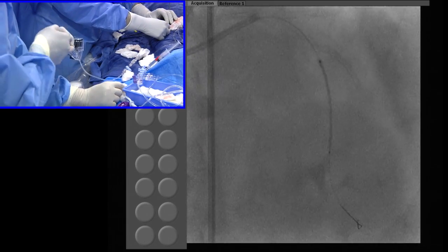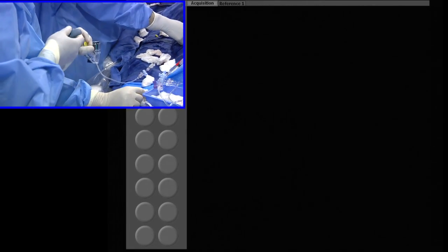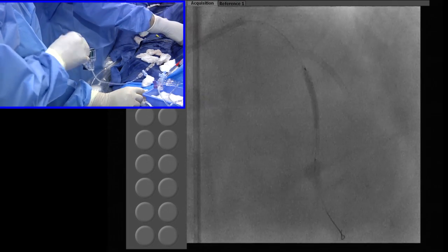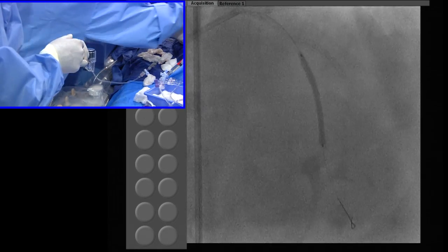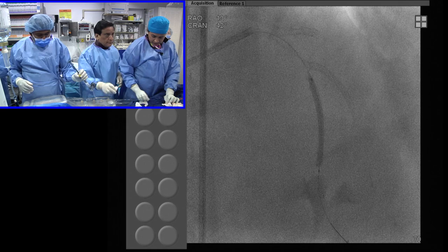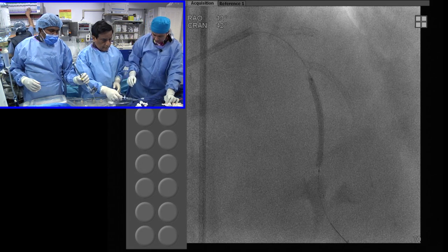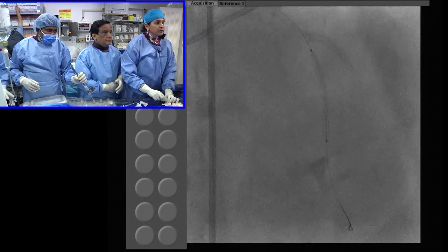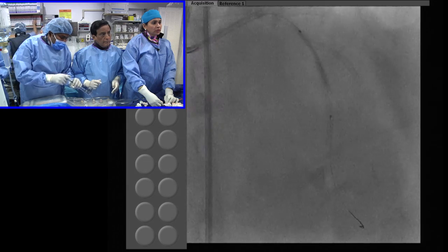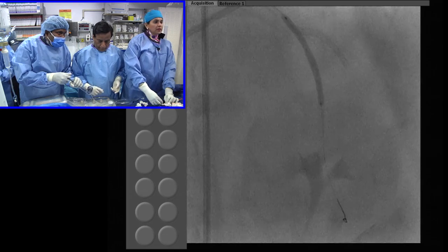This one you can go up quick. 6, 8, 10, 12. Good. Down. Go up again. Okay, good. Down. Now get us a 3.0 high pressure balloon. Go up here. You can go here, 20. No, not with this balloon. Good. Negative. Down.